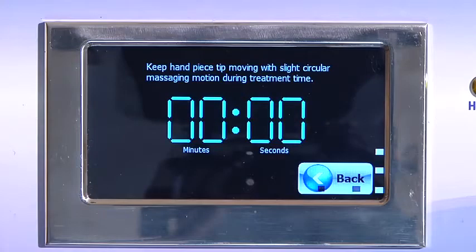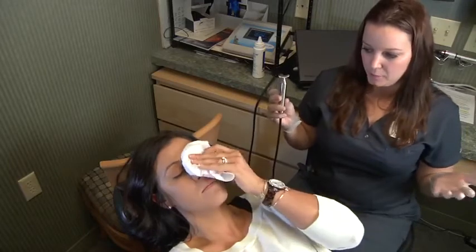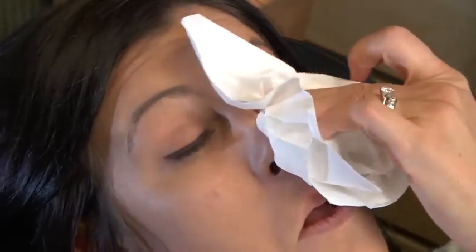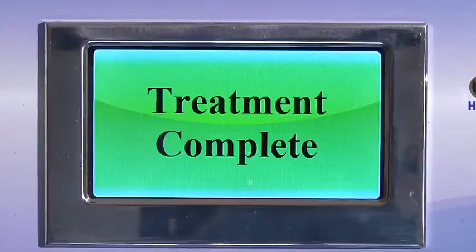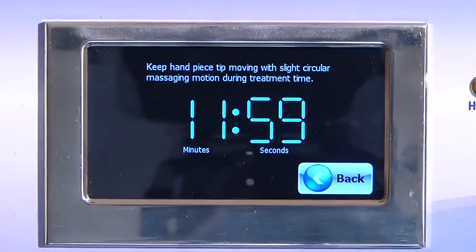When the timer expires, have the patient keep their eyes closed and clean off the excess gel with a tissue. You can now have them open their eyes. For treating the next eye, tap anywhere on the screen and you'll see the timer. Press start to treat the next eye.